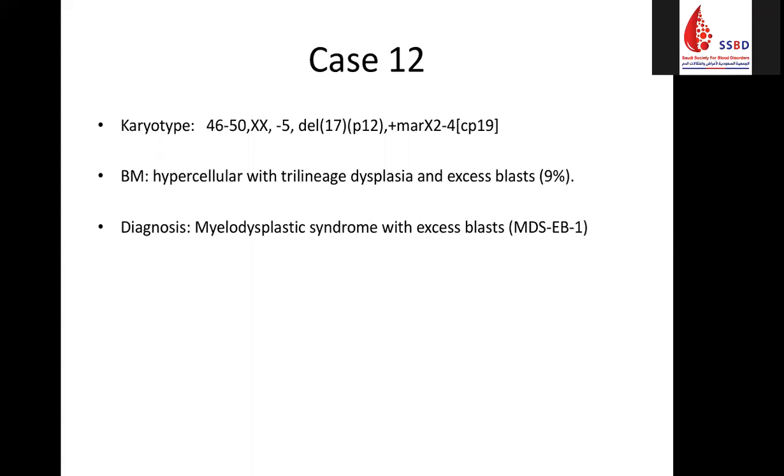So, as I told you, in the cases of MDS, peripheral blood morphology is helpful, yes, as a baseline. Before you do the bone marrow, you need to rule out that this is not due to nutritional deficiencies, or drug induced, or presence of infection, or related immunological diseases that cause the pancytopenia or the cytopenia. So peripheral blood is helpful, but not always, and the decision will be kept for the bone marrow.